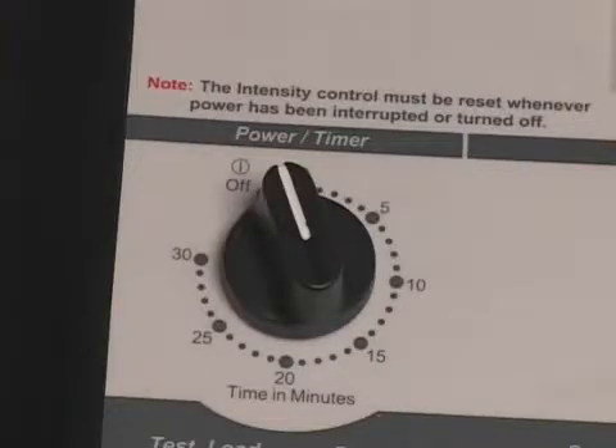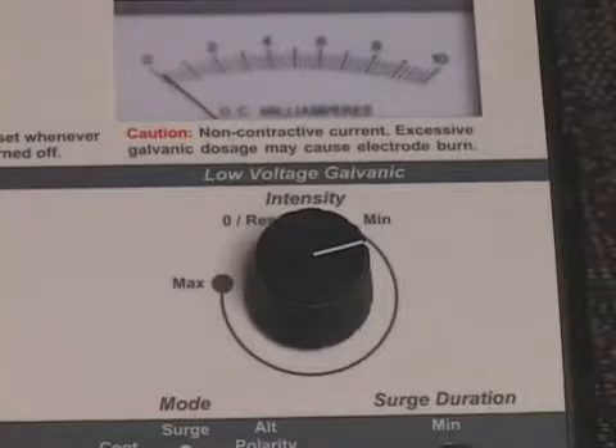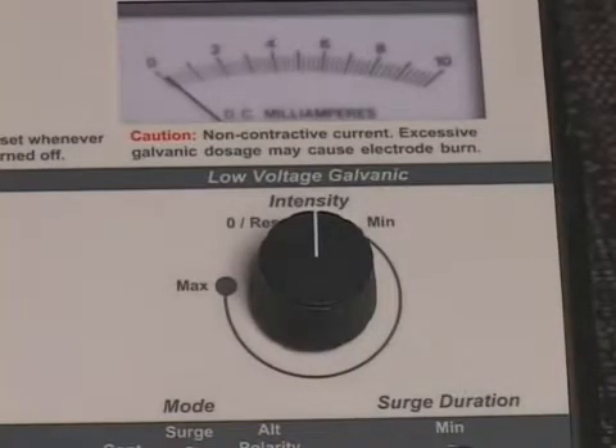When treatment is completed, the AC power will shut off and a bell will sound. To initiate early shutoff, turn the power timer knob counterclockwise to the off position; the AC power will shut off and a bell will sound. Reduce the low voltage galvanic intensity control to the zero reset position, enabling the audible click.